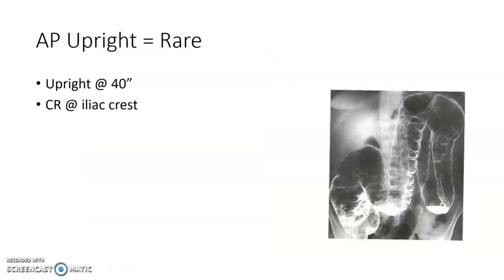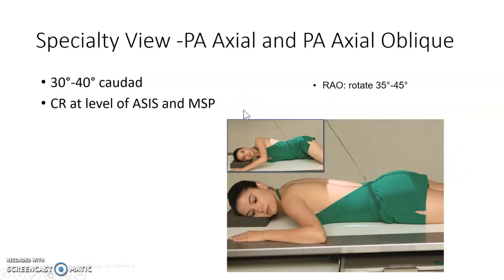An upright is extremely rare. I don't even think it's in your textbook anymore, but we used to have to do these when I was a student. It's an upright one, 40 inches, you center at the iliac crest. The air fluid level will just be a horizontal line like this one. So if you were to see that, that's an upright.